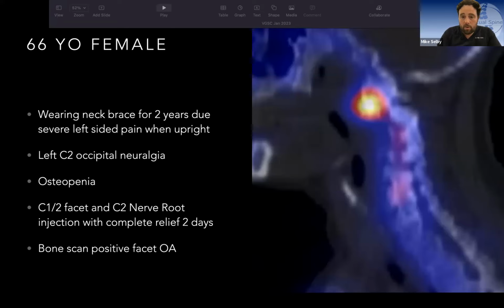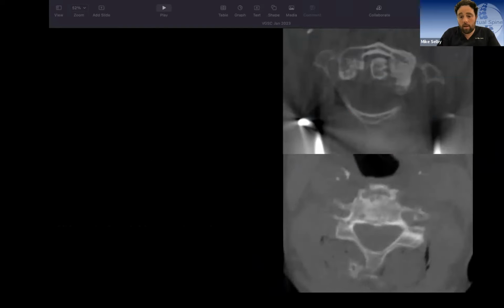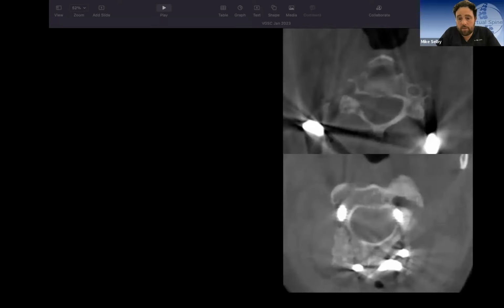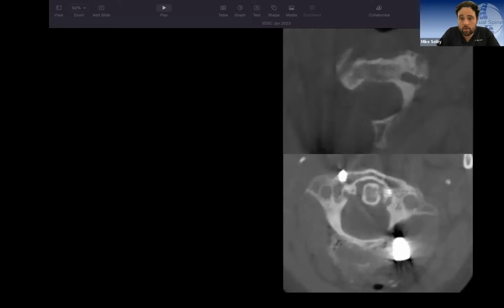She had an MRI that showed a bit of narrowing around the C2 root and quite severe osteoarthritis of the facet joint. So at the top level here is her first O-arm spin, because she'd failed non-operative management, and I took her to theatre. Sorry, the bottom level is her initial spin, and the top level there is the joint. I'll just run both of these through. So you can see here that she's got really dysplastic anatomy with the ectatic vertebral artery. She's got a very sclerotic C1-2 joint with bone fragments everywhere.